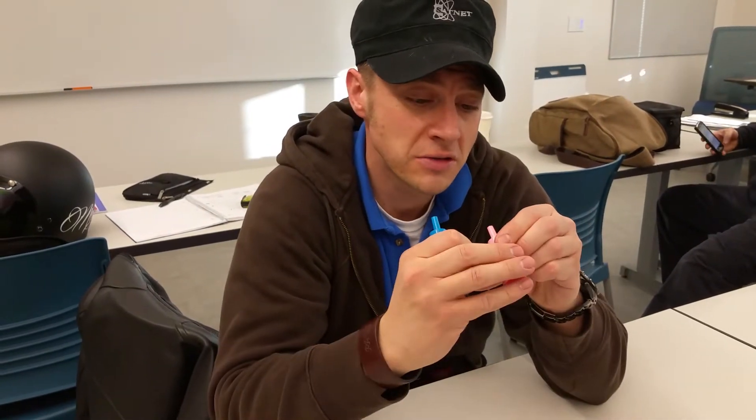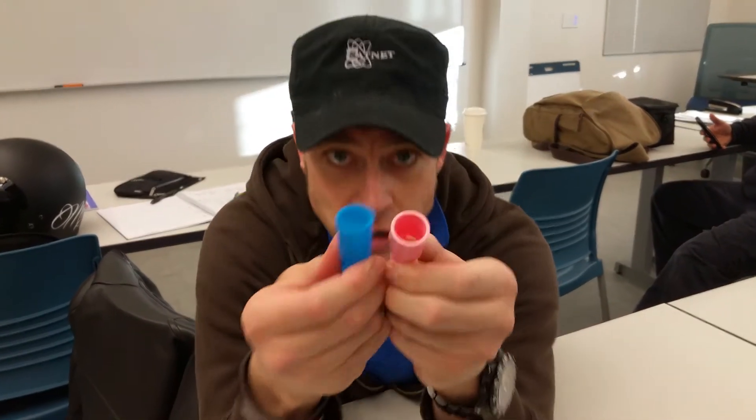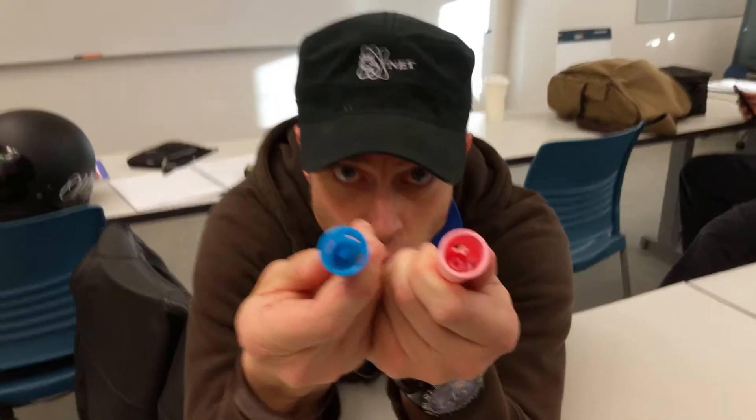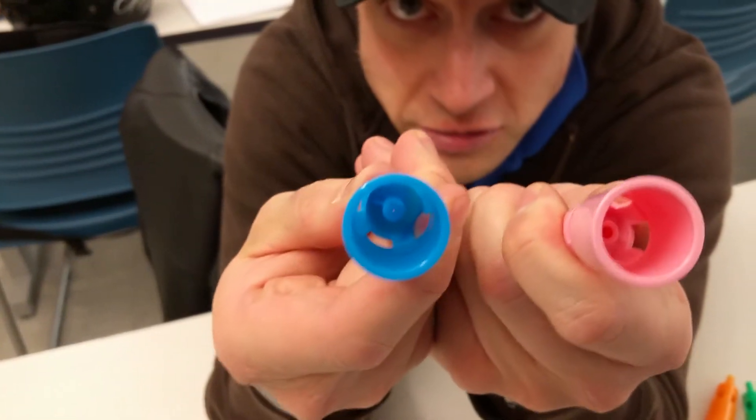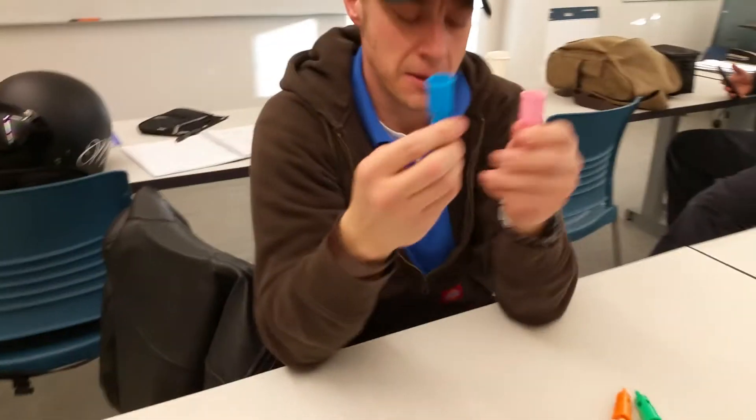This one is also 4 liters per minute at 28%, and this one is 8 liters per minute at 40%. Now if you look in here, you're going to see that the hole where the oxygen comes out of the tubing is either larger or smaller. That's how they get it.